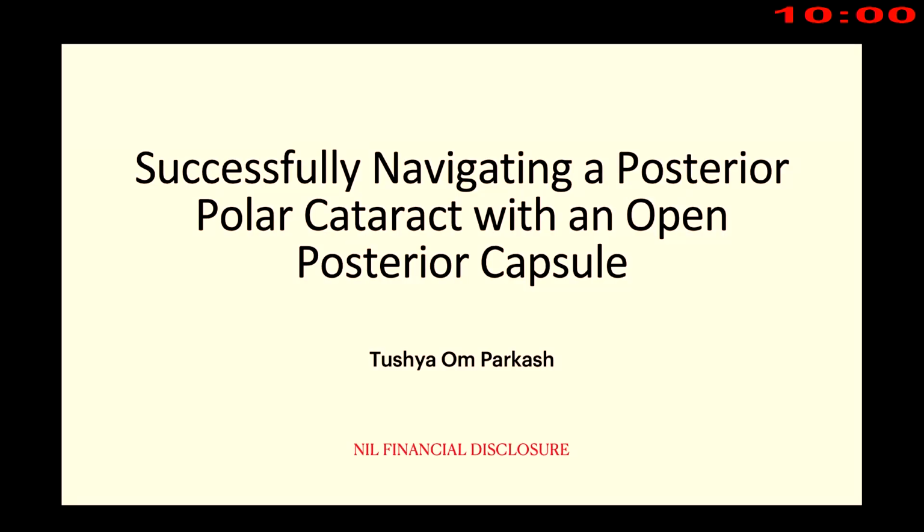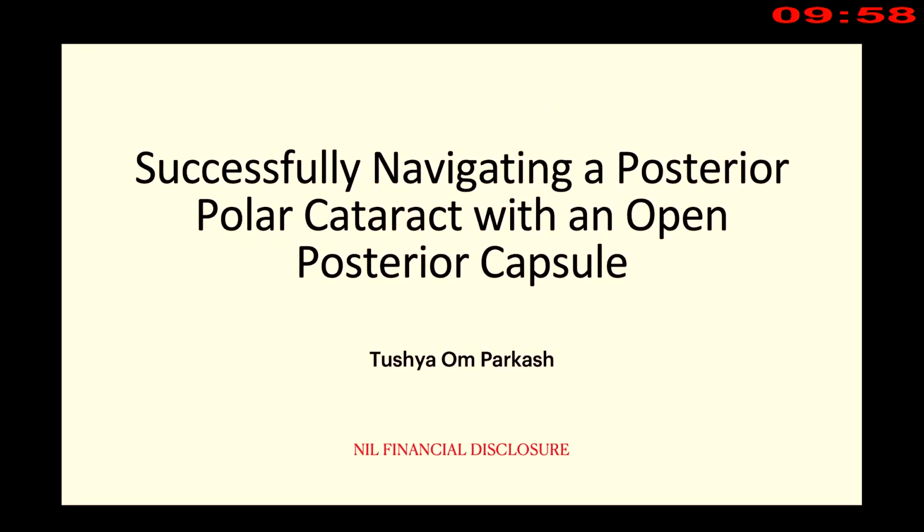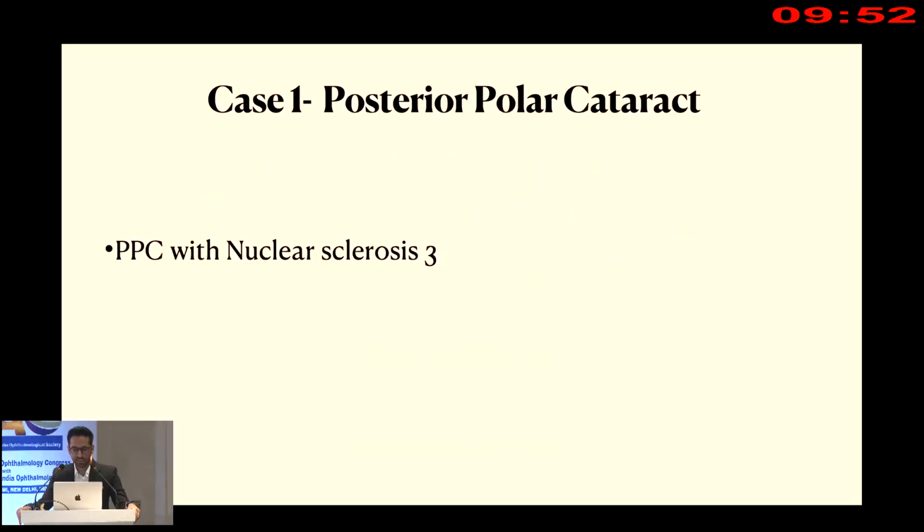I would like to thank Dr. Vishali for giving me this opportunity. So, I would be talking on successfully navigating a posterior polar cataract with an open posterior capsule. I'll be showcasing a few posterior polar cataract cases. This is the first case, a posterior polar cataract with nuclear sclerosis of grade 3.